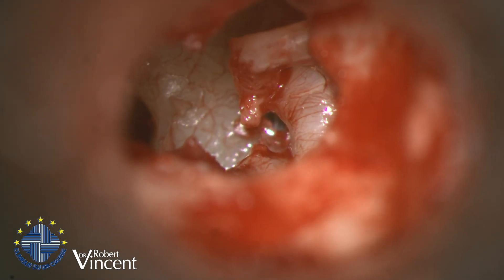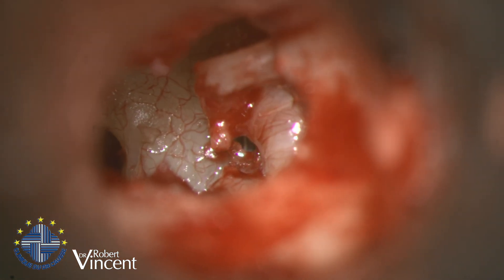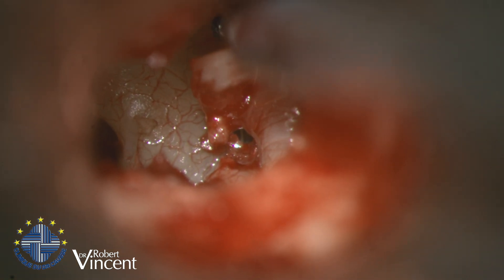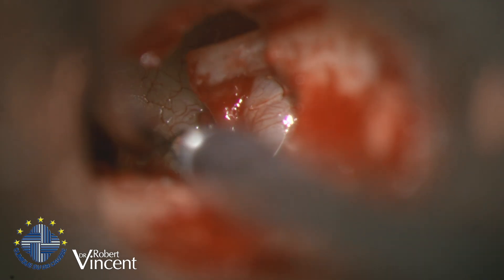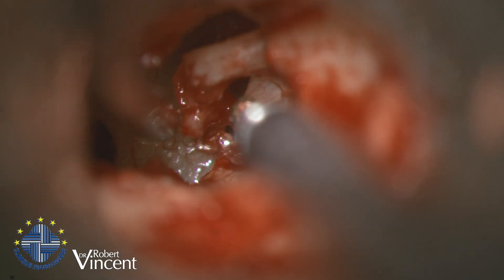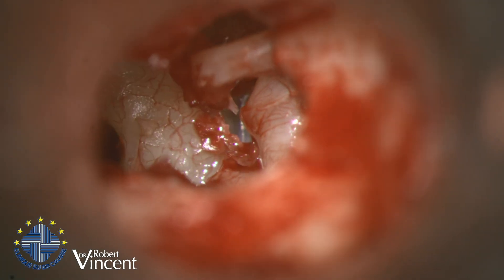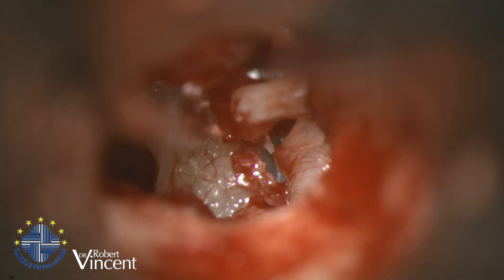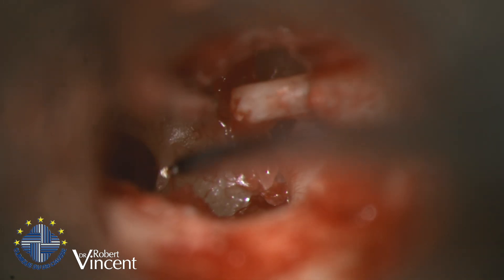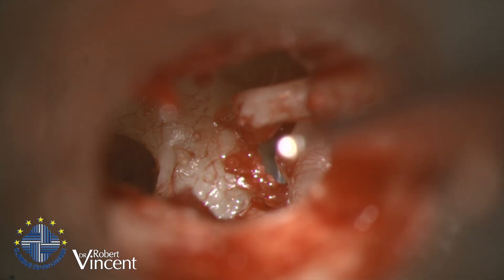I don't have access to the anterior crux. Let's see if I can access it with the micro drill anterior to the superstructure, but I don't think I can — there's no possibility here. The only way is to drill from posterior to anterior. It's done. I was able to dislocate the superstructure slightly, avoiding contact with the facial nerve, and now I can remove it. It's good that we had a really thin anterior crux, otherwise it would have been difficult.